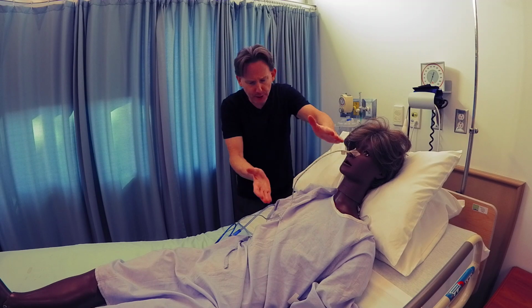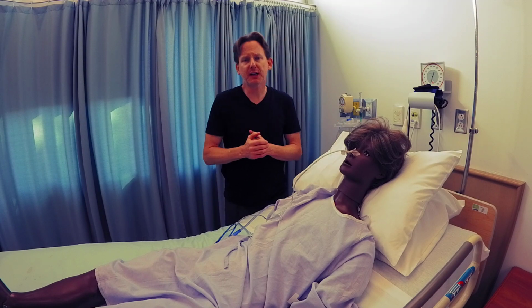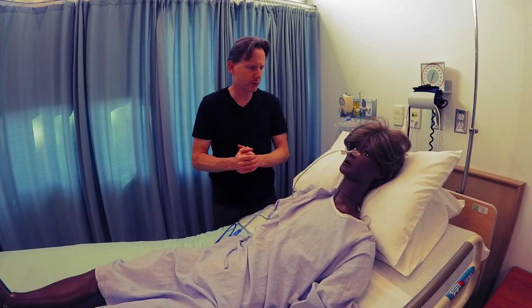Of course, if it's not in the right place, and we can see it already, then a registered nurse may want to push it in a few extra centimeters, or they might default to getting an x-ray just to see what needs to be done and take that advice. So that's one way of troubleshooting through the issue.